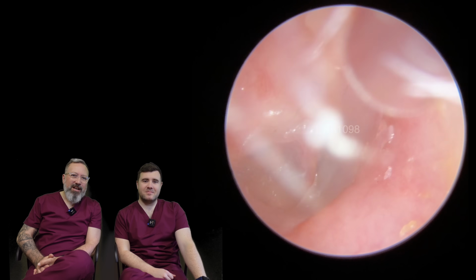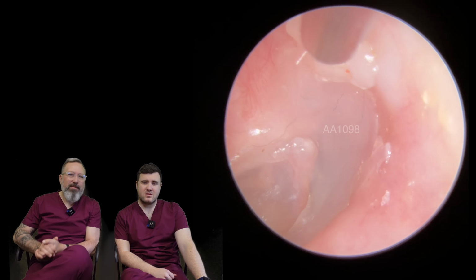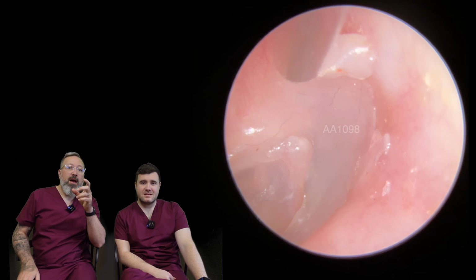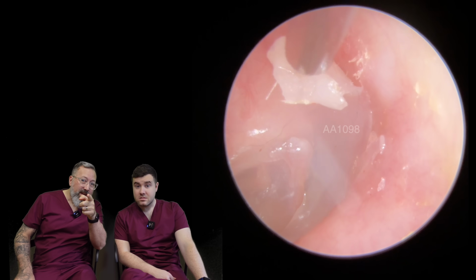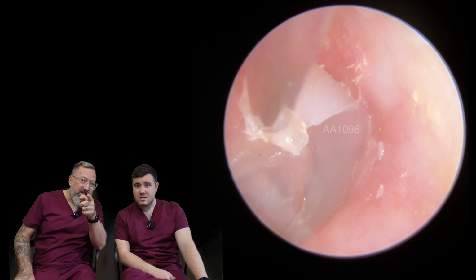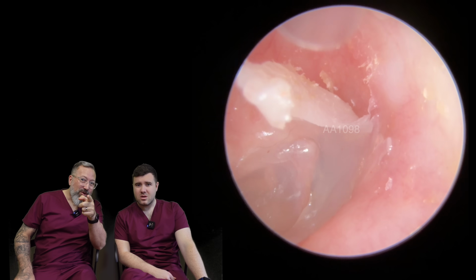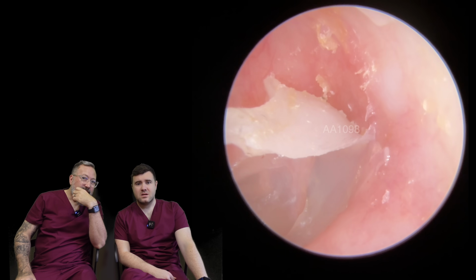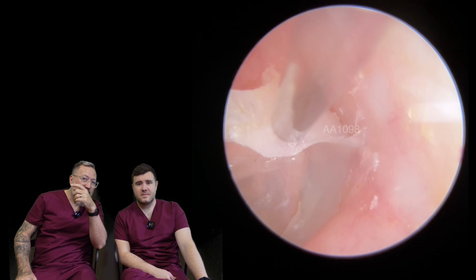So this is actually a layer of silicone earplug stuck to the eardrum, right? Because he's trying to get this out with a cotton bud. But have a look. It's only a short one. And you've got a lovely one from Taylor coming up next. But look at this peeling away. I thought, I don't know if I'm going to be able to get this out. But look how stuck that is. Watch the peel. So kind of follow as it comes away from the skin. I'm trying to fold that front section so I can get a grip of it further on.